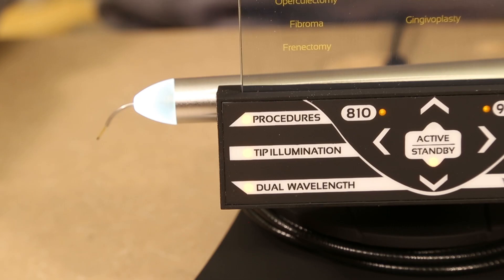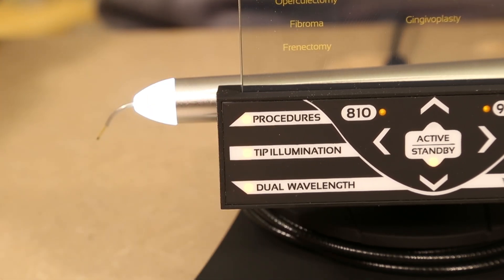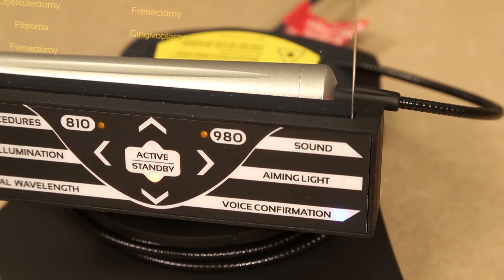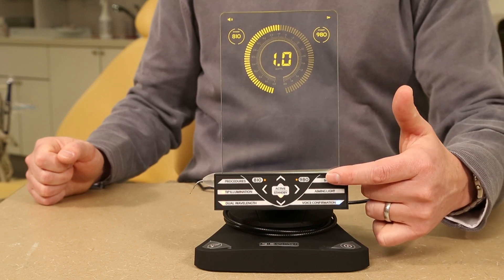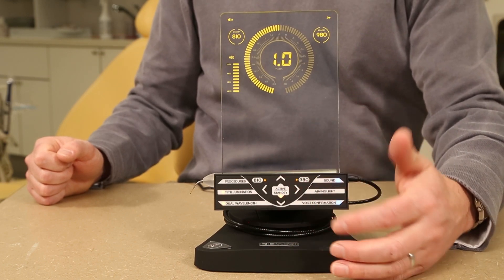To adjust tip illumination, simply press the tip illumination button which toggles between low, high, and disabled. To adjust the aiming light, press the aiming light button and use the up and down arrows to select the desired intensity of the aiming light. Please note that the aiming light is not the laser — it is an additional LED light that helps the operator direct the tip to the desired location.